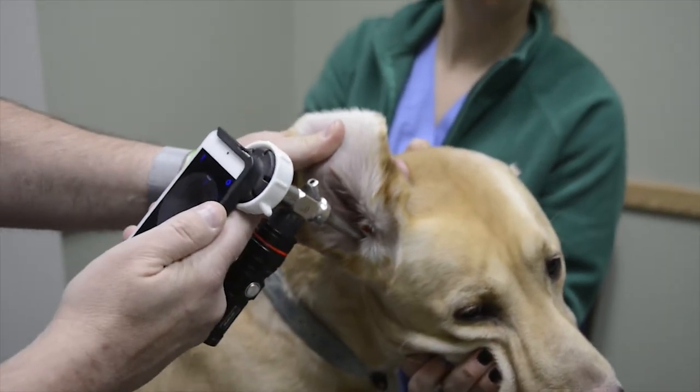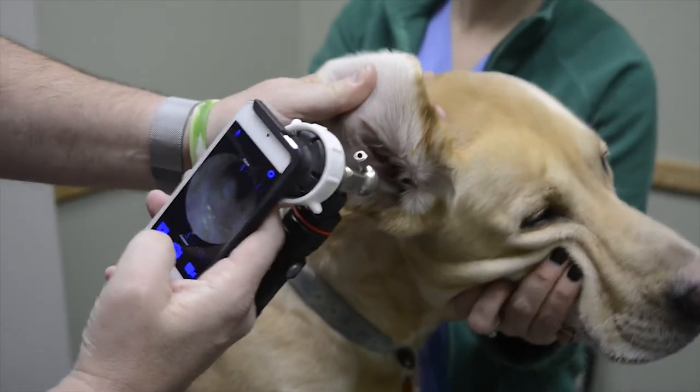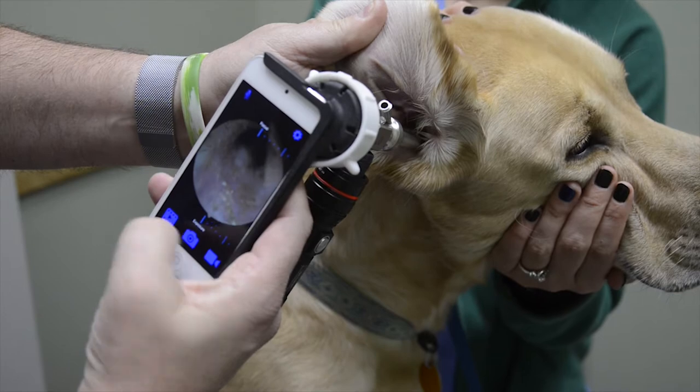To focus the image, touch the screen in the middle of the screen. Tap the camera to take a picture; tap video to take video. Images are stored under the film icon.